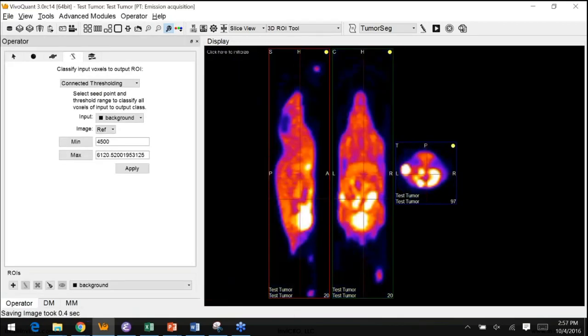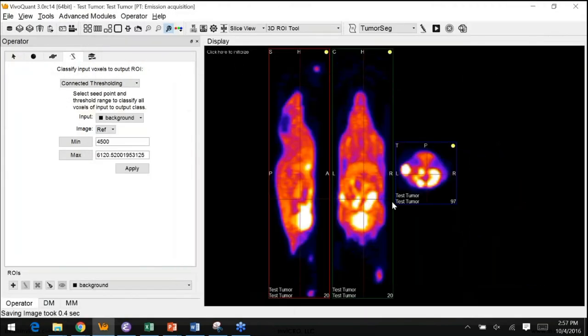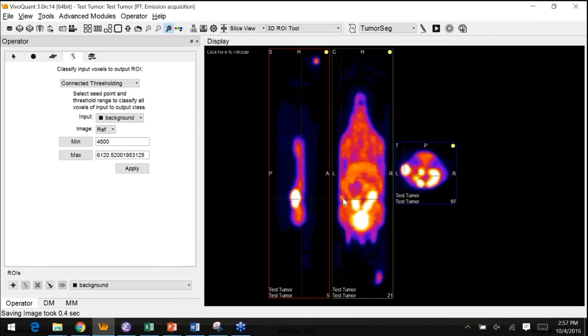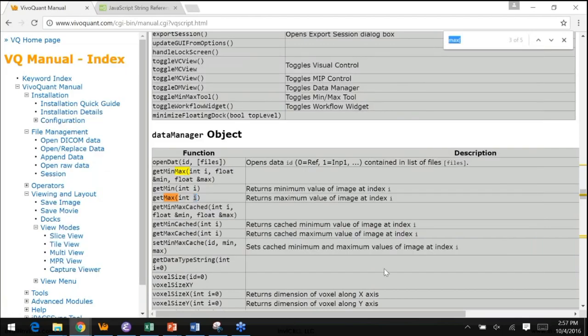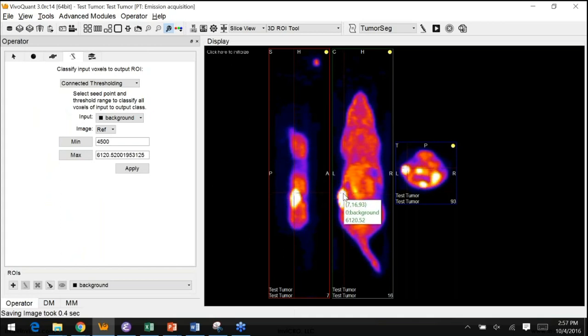And just remembered I forgot something, so I know that this is not going to work. You see there, we don't have a tumor ROI, and we can see that in our QC image too. The problem is I didn't set the seed point. So the seed point can be set through the view controller typically. Here I provided a manual seed point, so I will have to do that here if I'm going to automate it.